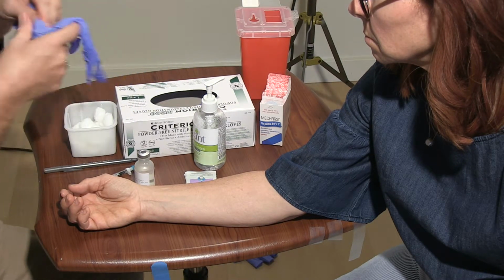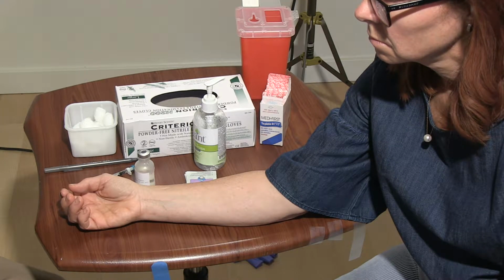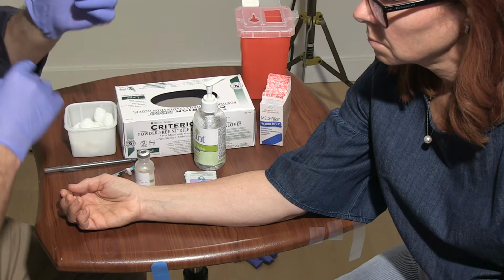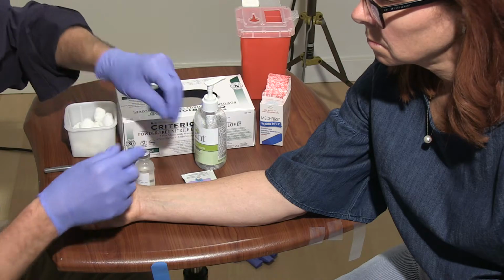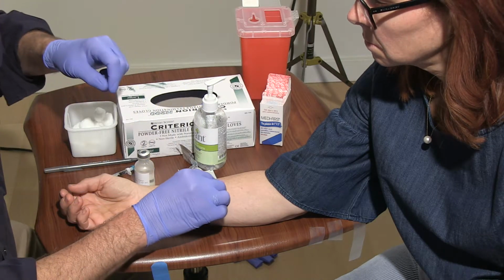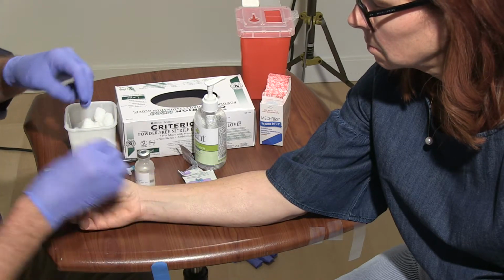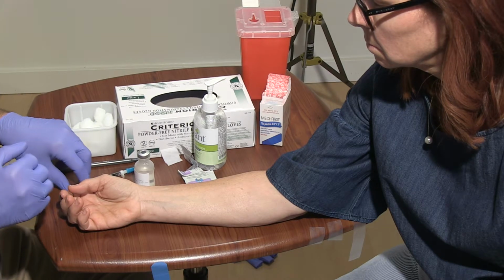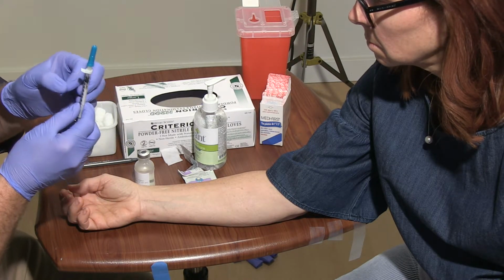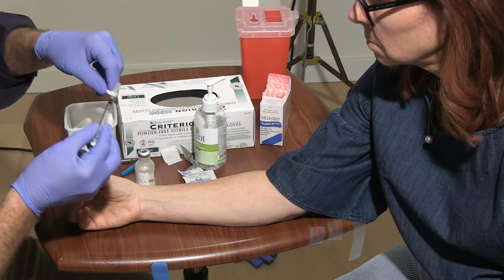pulling out my gloves. Taking my alcohol wipe to clean the area. And take my tuberculin syringe. I'm going to examine, make sure there's no air in the needle.